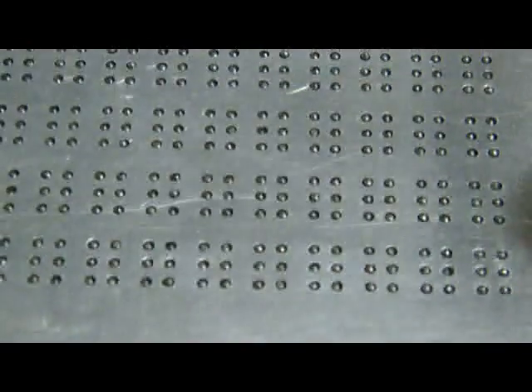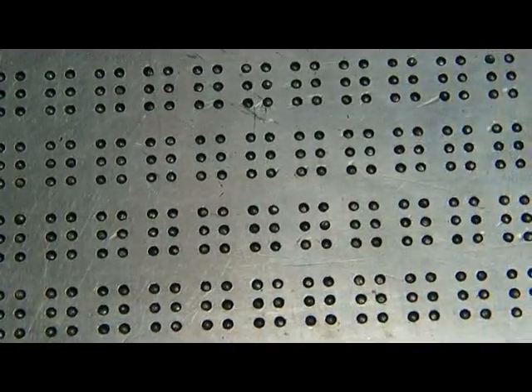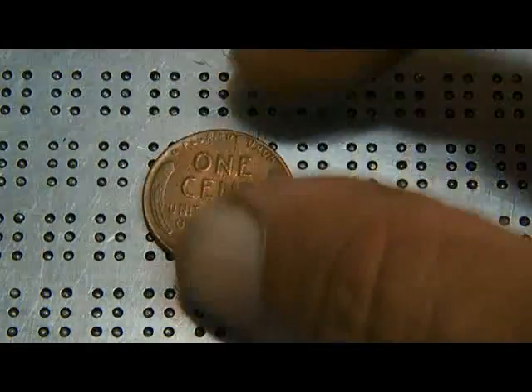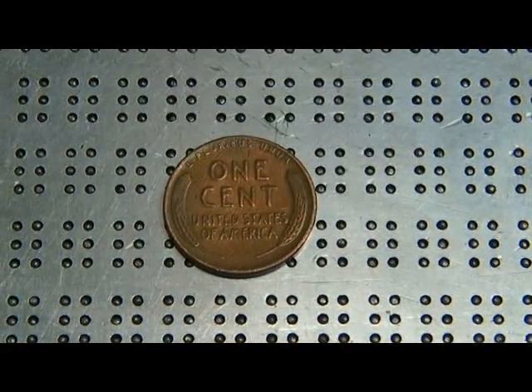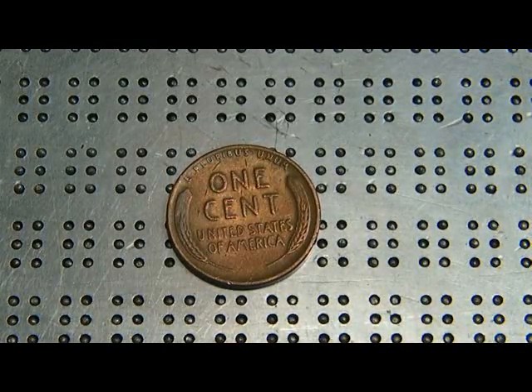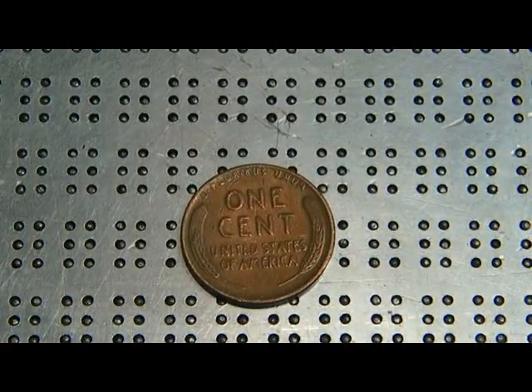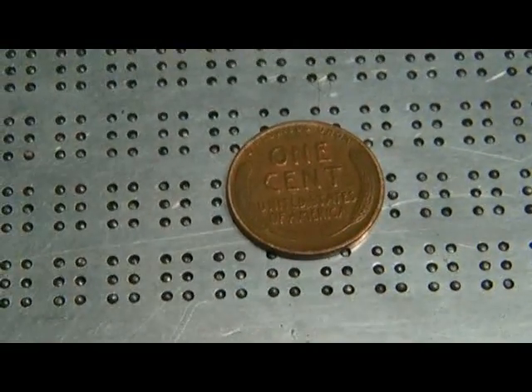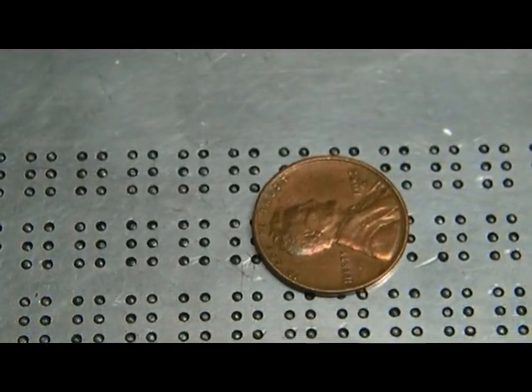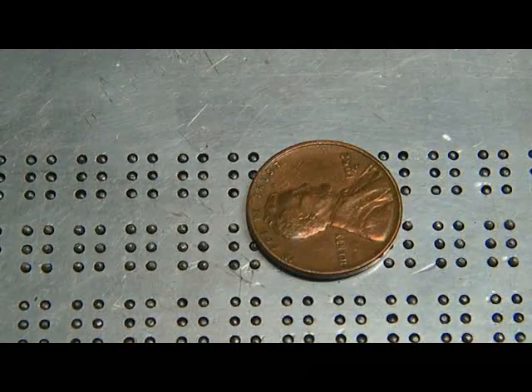So that's basically how you can control pins in every row and column on this display, and it's made to actual scale and size. You can see the 1 cent fellow. You can see the force with which the pins are toggled. They literally cause the penny to jump up and down. Watch that. Got him to flip over there. That's something that I don't think any other design has the ability to kick up with so much force.